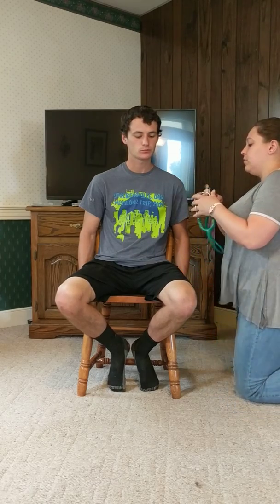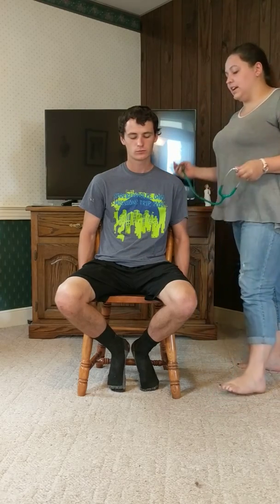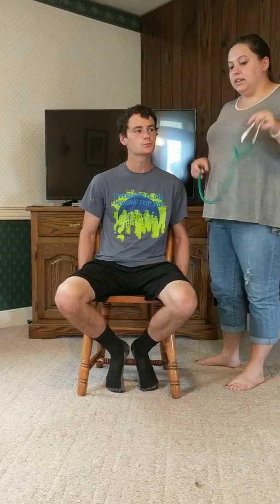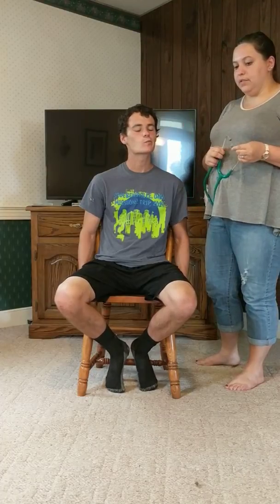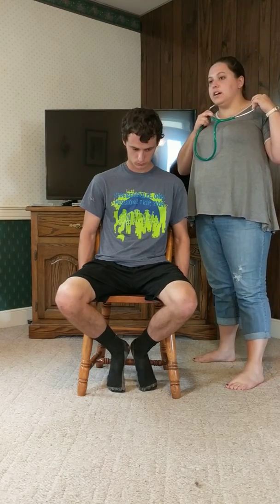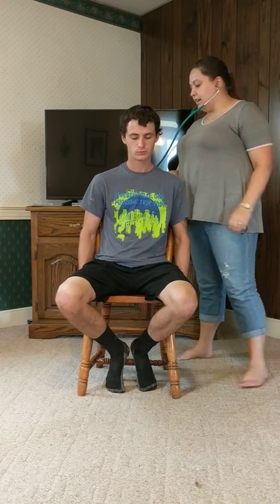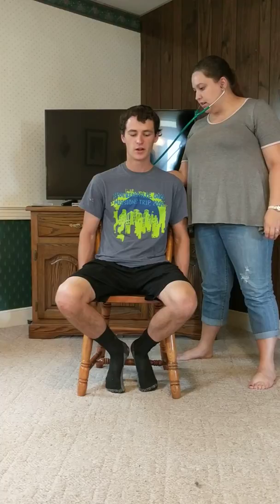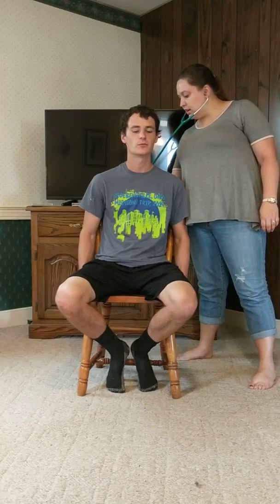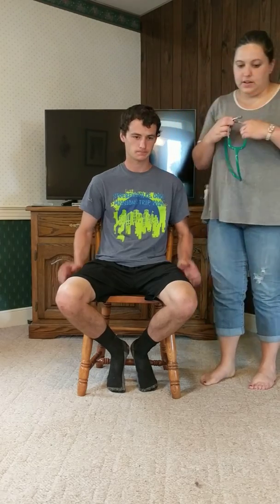For bronchophony, what you do is you also take the stethoscope while the patient is saying 99. If there's any increase in the volume, that's what would give you the indication for consolidation, suggesting fluid buildup or even something like cancer. So I'm going to have you say 99 again. 99. Again. 99. Okay. All right.